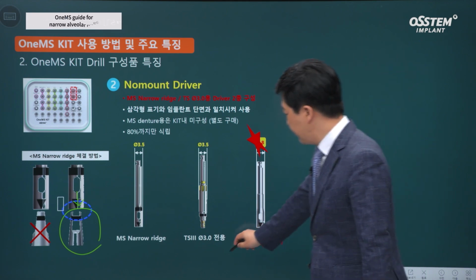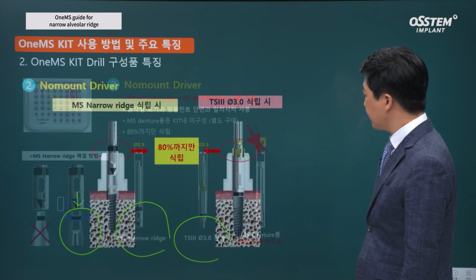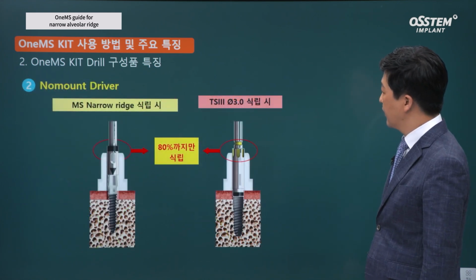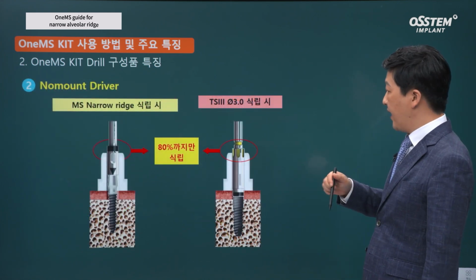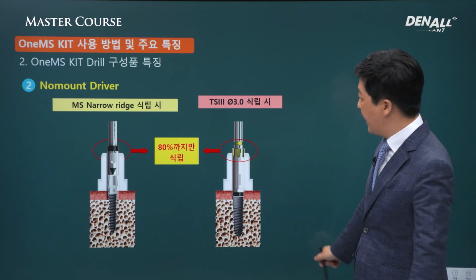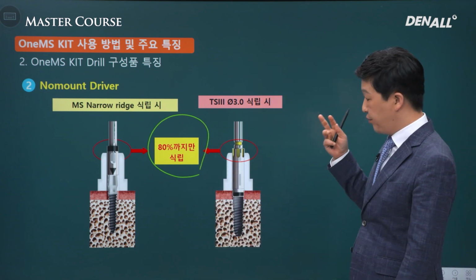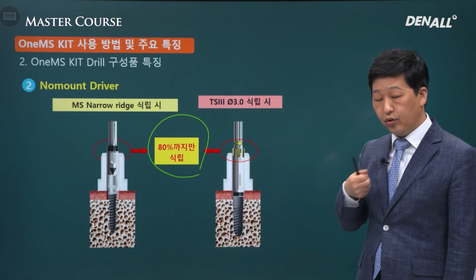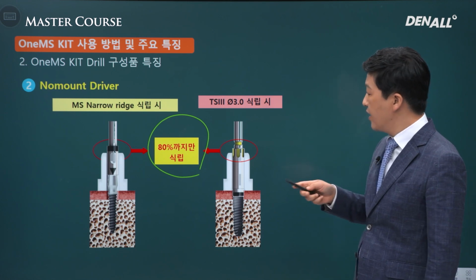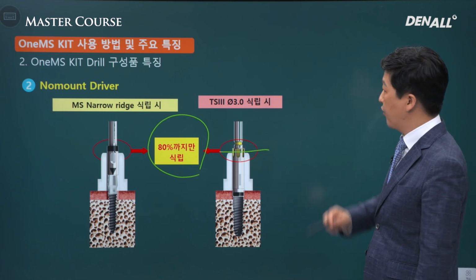There's a separate one for TS and MS. When placing implant, rather than placing it to full depth using engine, you place it about 80% using engine, and as for 20%, you apply manual torque to get the final position. That is the recommendation.